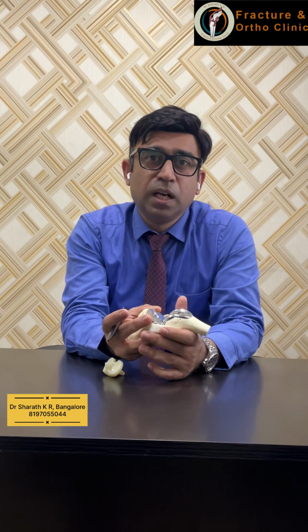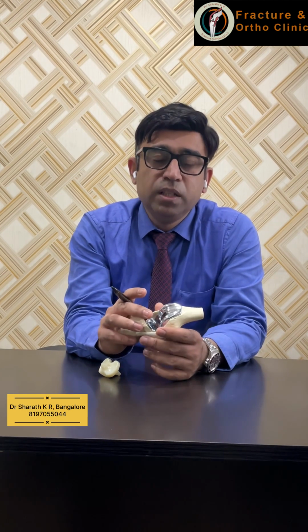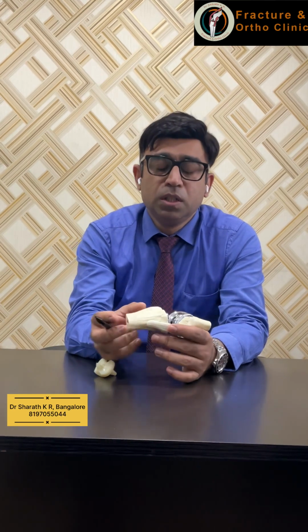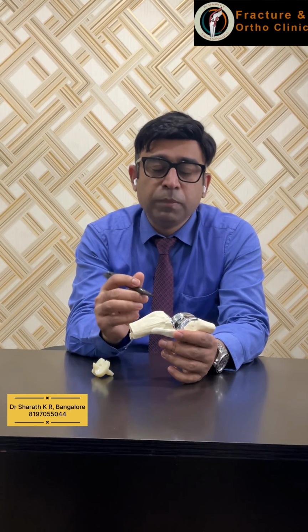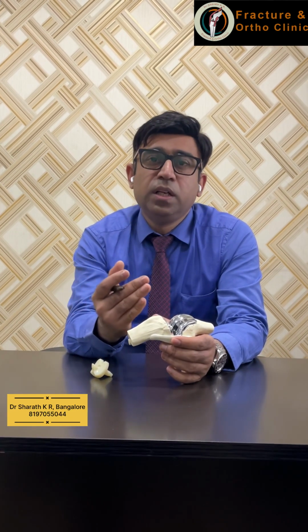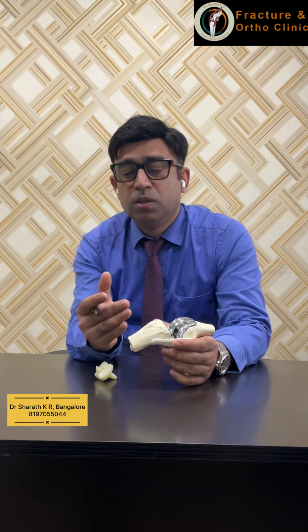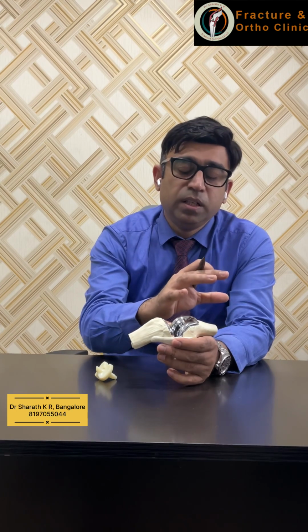I am explaining in this video about the personalized alignment in simple language so that it can be understood without any orthopedic background. Before we go to personalized alignment, we should know that in this particular MAKO robotic system, we will be feeding the system with the 3D images of the knee of the particular person we are doing surgery on. Then this image of the 3D CT will be shown in front of us during the surgery. Based on that, we will be doing surgery.